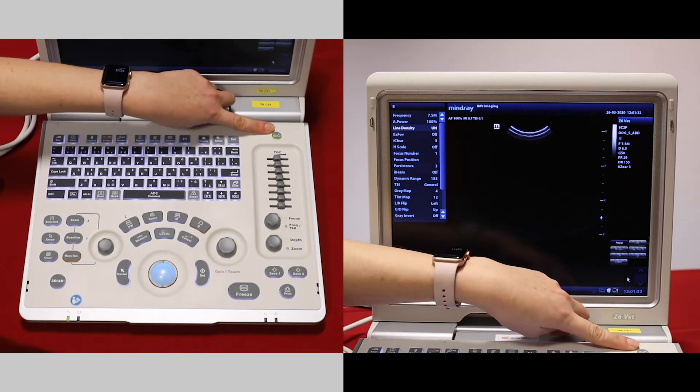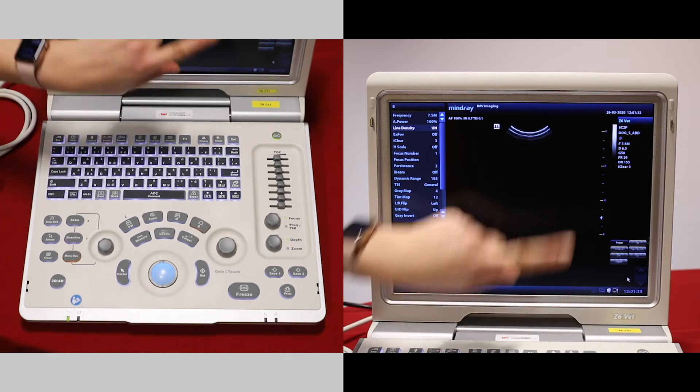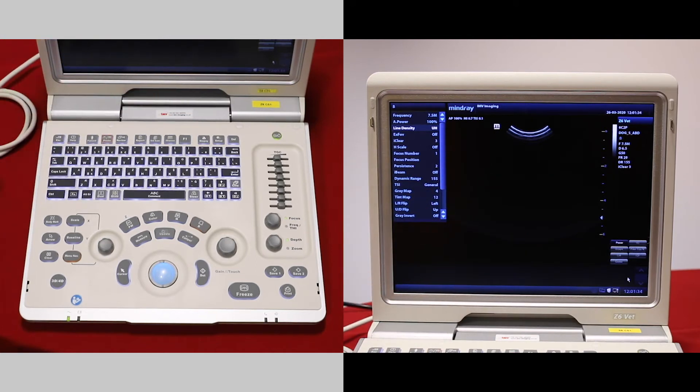When you first turn the machine on it brings you to the scan screen, but we need to input patient details so any images we save will be saved to that correct patient.